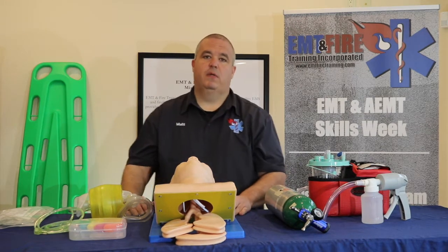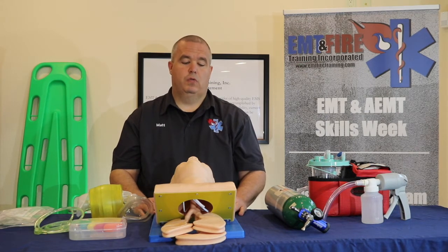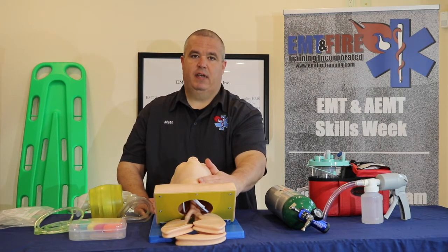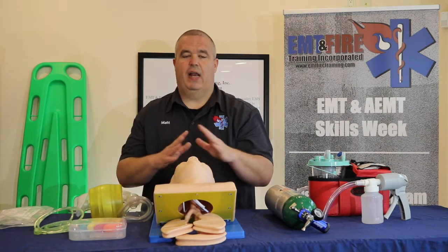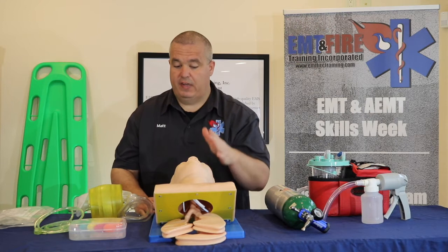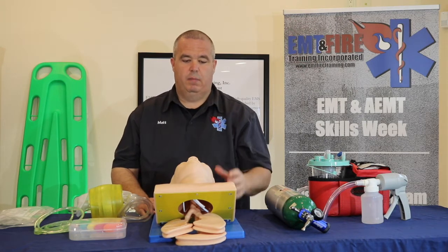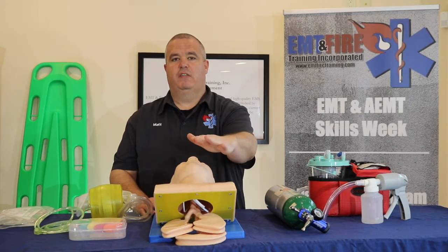If this patient still doesn't respond, we need to check that he is breathing and has a pulse. We check for a carotid pulse for anywhere between five to ten seconds. We also want to check his breathing at the same time. I like to just watch their chest rise and fall — some people put their face near the patient's face to feel air on their cheek, but I prefer to just check a pulse for ten seconds while watching chest rise and fall.